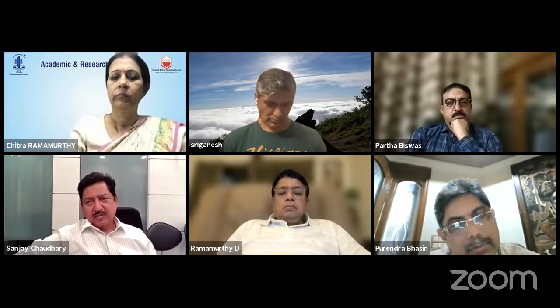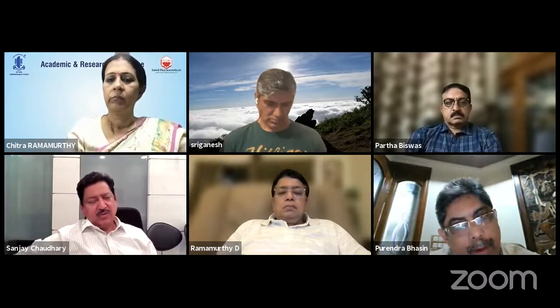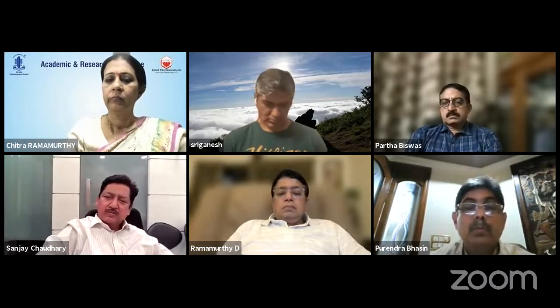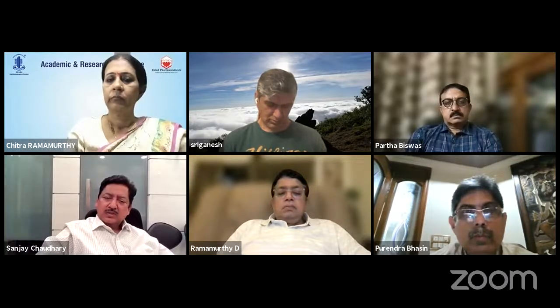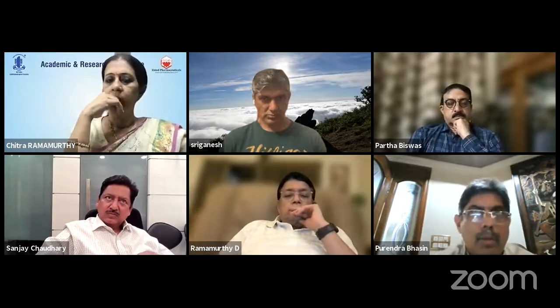I have one question, Dr. Sanjay. Did you do a PI in this case, a surgical PI? No. Okay. Two routine things come to my mind. One is a cyst which got ruptured, as Dr. Purendra said, and Dr. Chitra and I were thinking about that. So UBM could have probably solved the problem. Or maybe if you did a PI and there's a late leak which got collected there due to viscoelastic, and now since the viscoelastic is gone, slowly the pigment release from the PI is coming in.